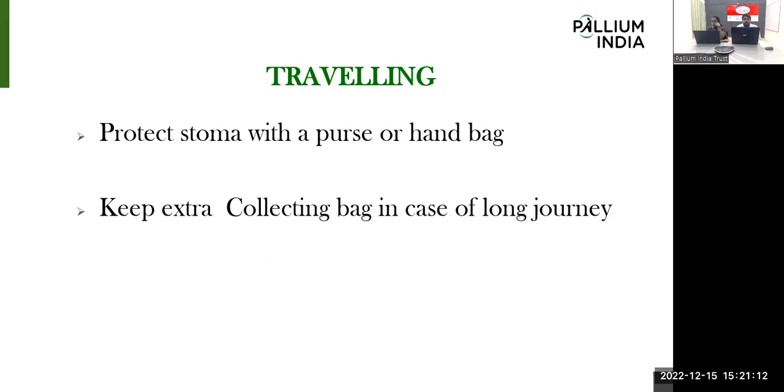So we need to educate the patient while traveling, mainly in public transportation. Depending on the travel, they need to carry a purse or any handbag, just for placing upon the stomal area, to avoid any accidental injury during traveling time.